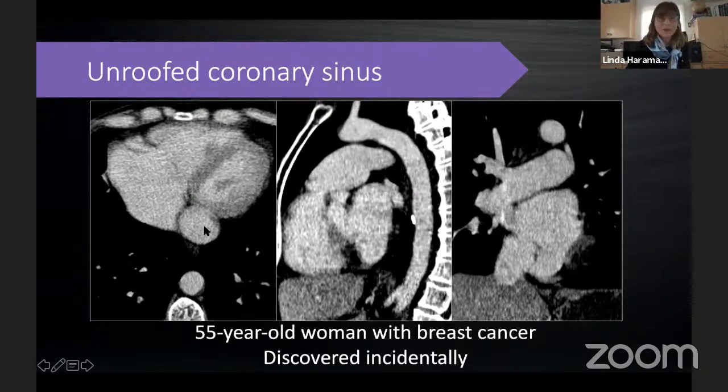Here we see the left ventricle. And this is actually not the left atrium. This is a markedly dilated coronary sinus. This is a straight sagittal reconstruction because this was a diagnosis that we made retrospectively from the chest, abdomen, and pelvis CT after we'd lost our primary data to do fancy reconstructions.